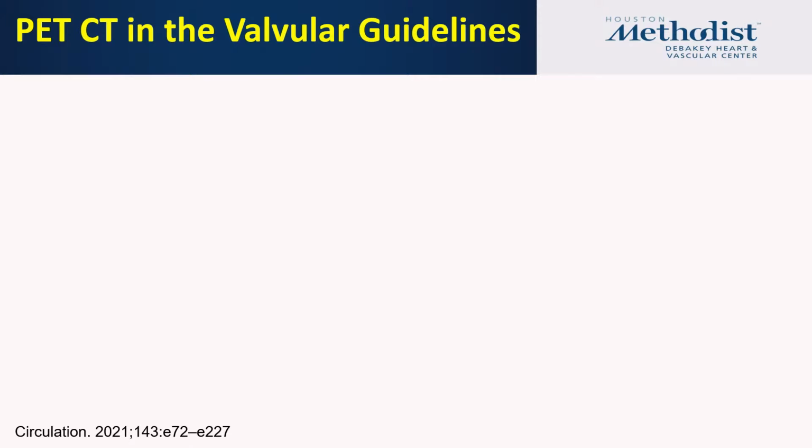So the Europeans have been way more advanced in this, and this technique is actually more developed in Europe and more routinely used here. In the US, we're starting to use it more often, especially in the LVAD and pacemaker population, in addition to complicated cases from prosthetic valves where CT or echocardiography could not provide a final answer.